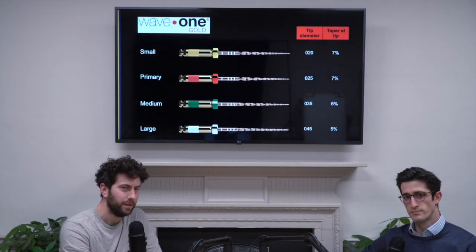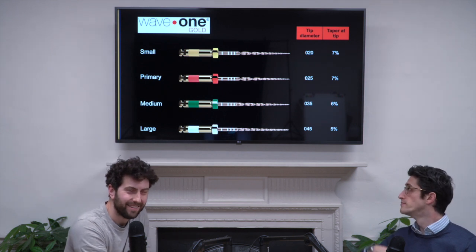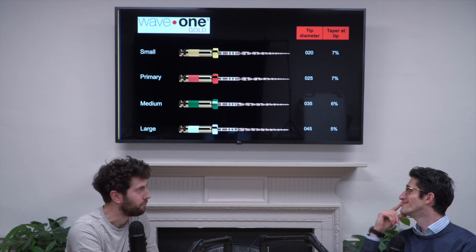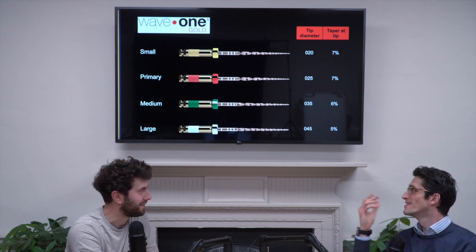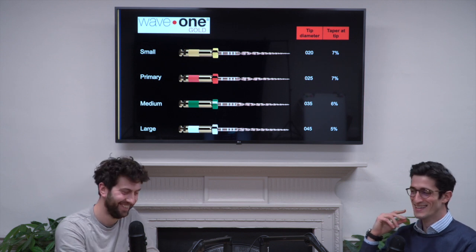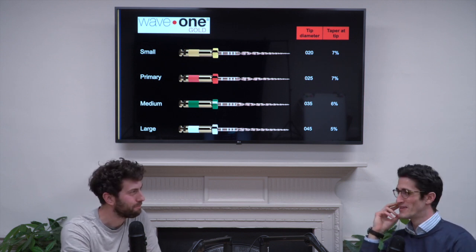And then you've got the WaveOne Gold family, and it always annoys me. I sort of look at the bottom of the screen and there's sort of the red, green and white, and it just reminds me of the Italian flag, Lucas. Just quality, like the Italians, really. But they are Swiss made, so fair enough.